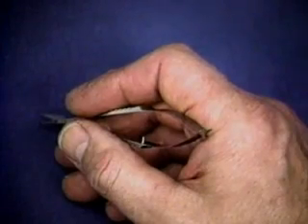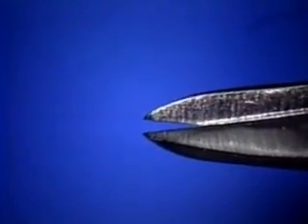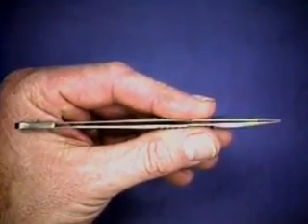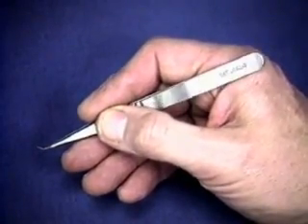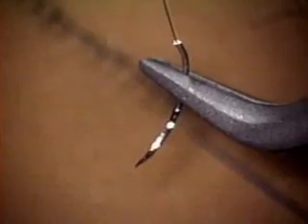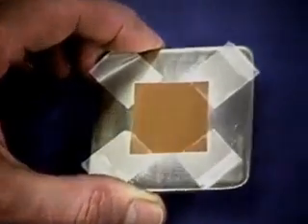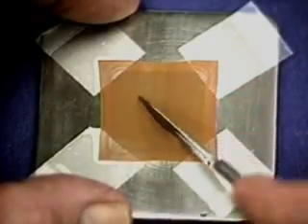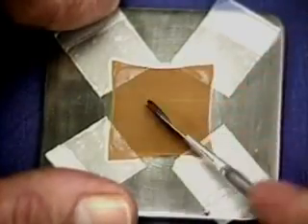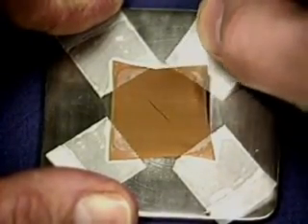Here are the instruments you'll need: a pair of scissors with fine pointed tips for cutting the suture; a straight jeweler's forceps for your left hand with tips that meet nicely; and an angulated jeweler's forceps for your right hand, which is both a needle holder and a tying forceps. The material we work on is a piece of regular surgical glove rubber stretched under very slight tension. Cut it with a knife and you've got a wound to stitch. If it pops open like this, the rubber is stretched too much — you'll need to slack it off a little.